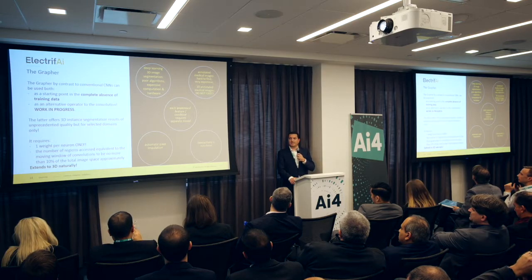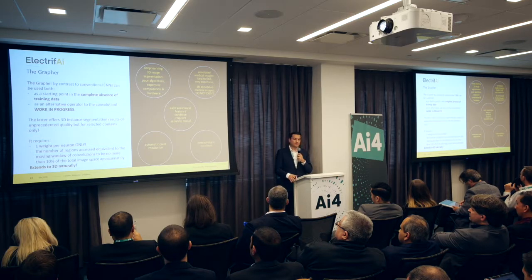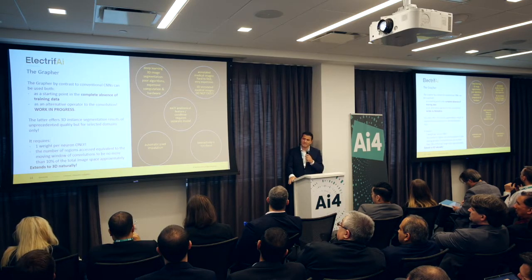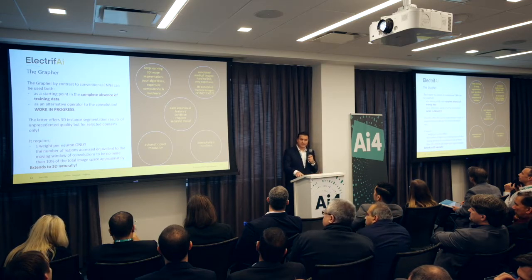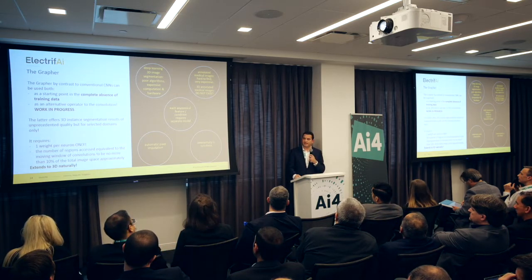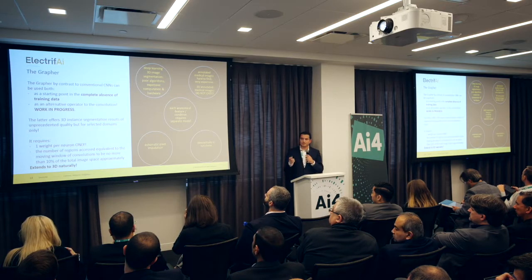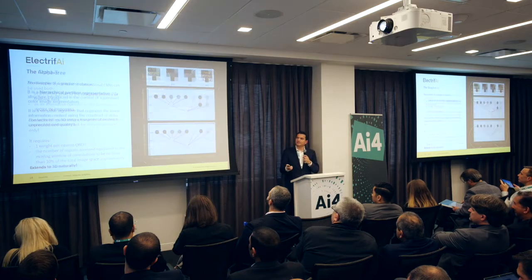And the number of regions accessed, equivalent to the moving window in the case of convolutions, is no more than approximately 10% of the image space, which is massive if you think about the fact that in the CNN approach you've got a sliding window that scans through the entire content of the image, and for every pixel it centers itself, gets a neighborhood and does what it does. So this is work in progress. Hopefully next year we might be able to report something more on this.